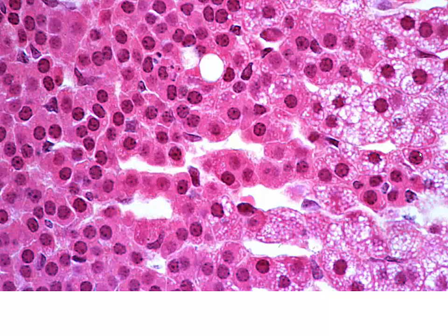Now, here's another area where you really need to see the associations one for another. If not, then you're just sort of looking at parenchyma. You sort of think that it's secretory epithelium, but you're just not sure. So as you see the spongiocytes, the fasciculata melding and changing and transitioning into these cells, notice these are no longer arranged in little bundles, acini, glomeruli.